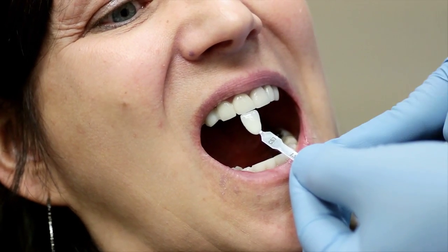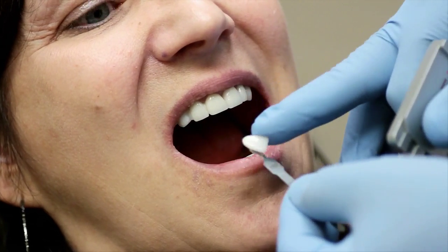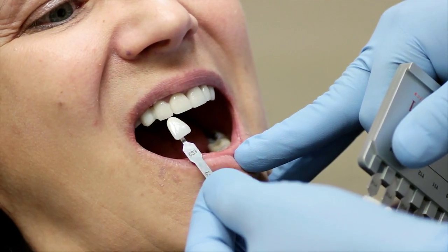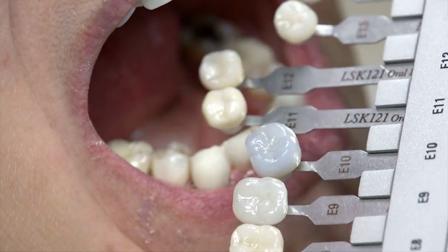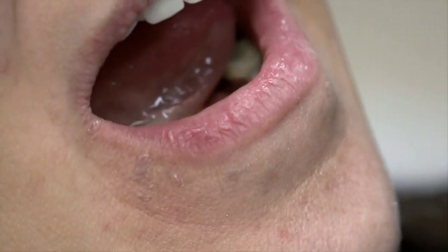With Seasons of Life, that loss of time and money will be drastically reduced, if not entirely eliminated. In return, your patients will be extremely pleased with their end result. You may also benefit by receiving referrals from satisfied patients.